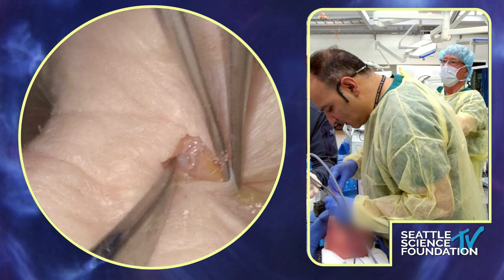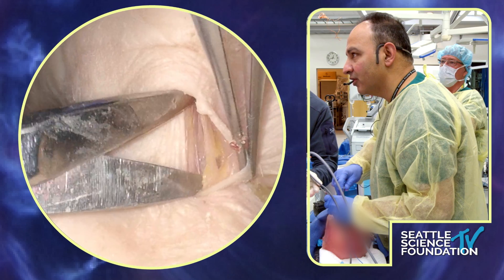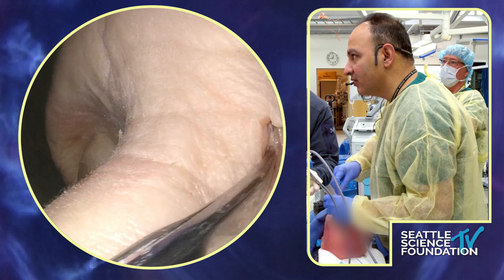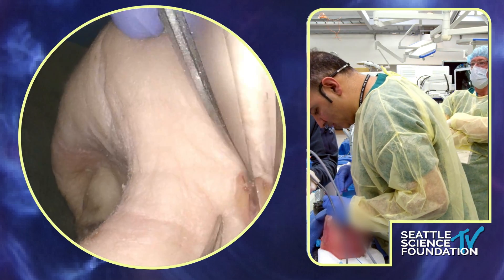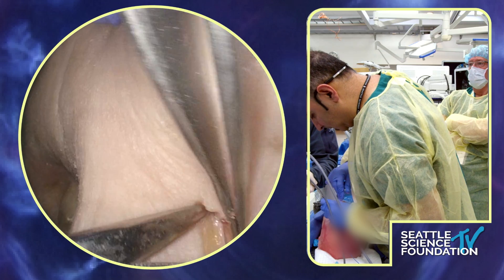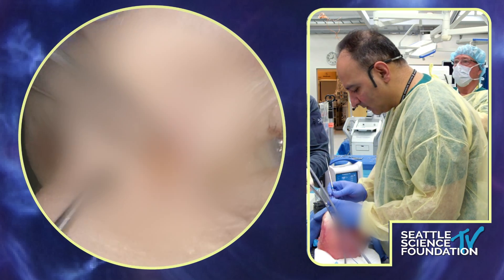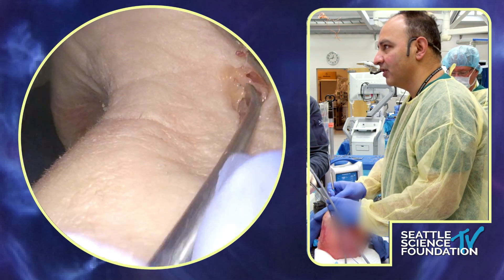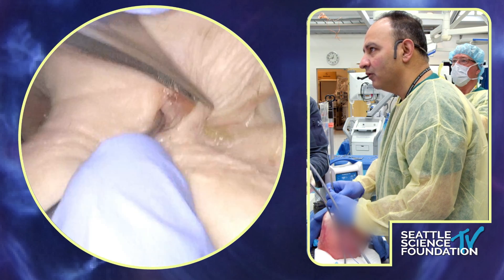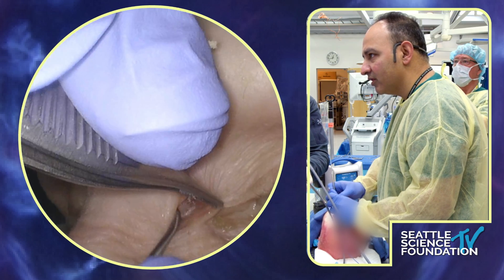We're going to work our way onto the bone here. With a few spreads we should be there — you can see the bone there quite nicely. Once we've got that, we can tunnel our way into the periosteum. This is a good place to use the cottle. You guys should do this endoscopically for fun. Let's see if I can find that plane I've created. Arif is saying that he does this endoscopically once he's made the incision and worked his way down, which seems quite reasonable.